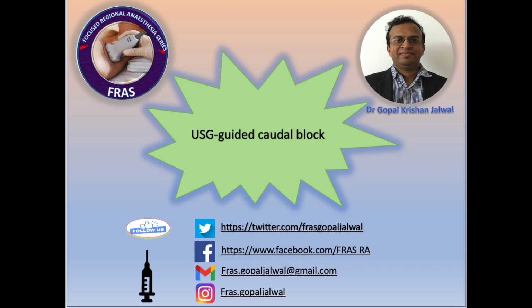Today I will demonstrate how to perform the USG guided caudal block in pediatric patients.